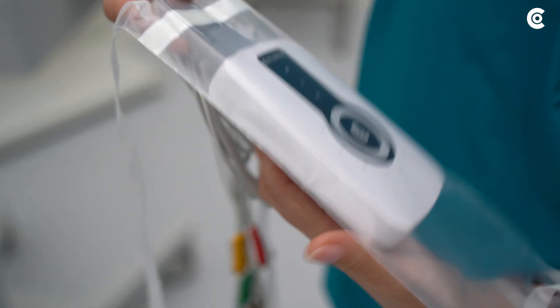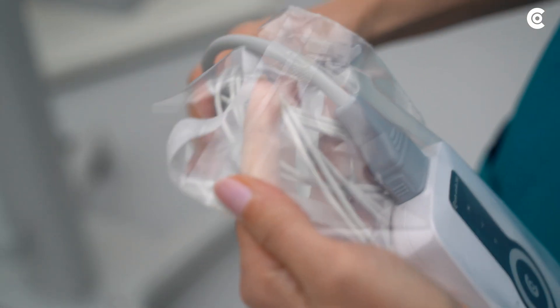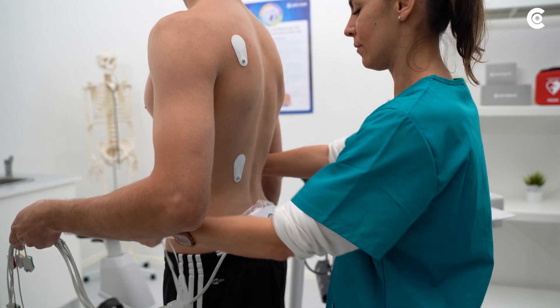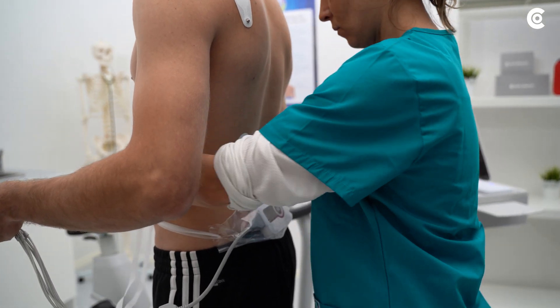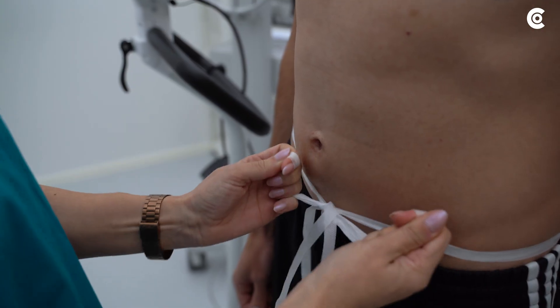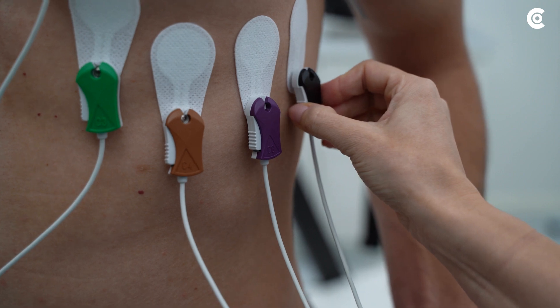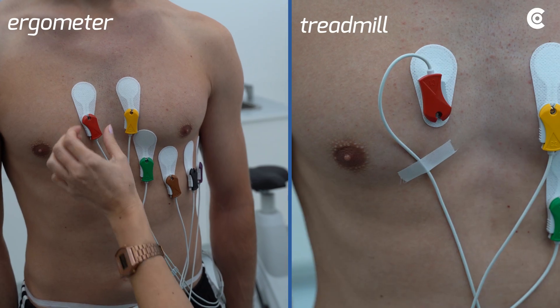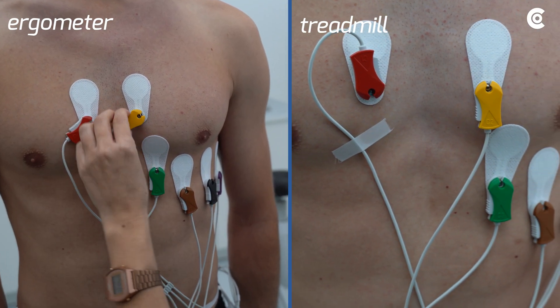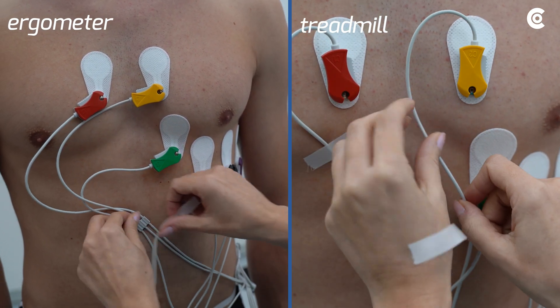Protect the Custo Cardio 300 with a Custo Clean disposable bag and attach it to the patient. Make sure that it is firmly supported and tie the ribbons tightly on the patient. Then put the clips on the electrodes. Ensure that there are loops which provide enough flexibility when the patient moves.